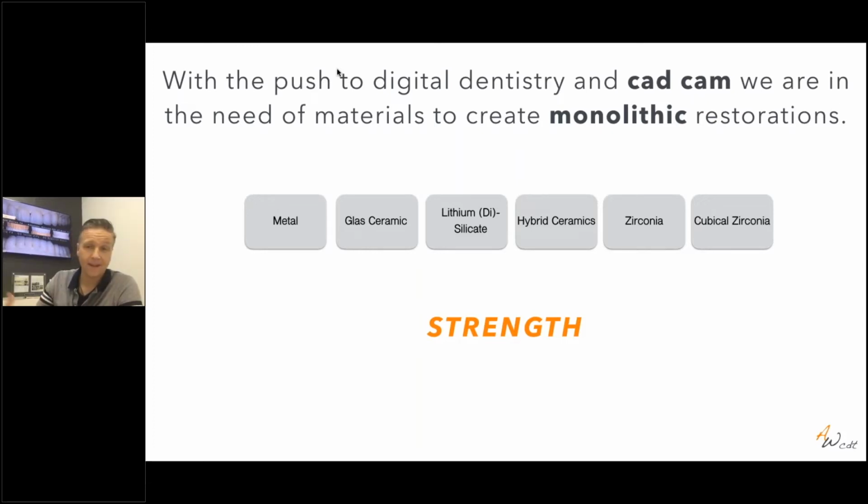They're calling us, saying, hey, I need a very strong crown. It's a bruxer patient and everything else chips and cracks and so on. So can you give me something very strong? And usually we dive in and say, oh yeah, of course we can do Zirconia. I mean, there are many other options.